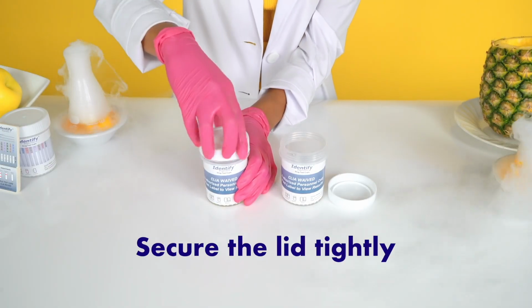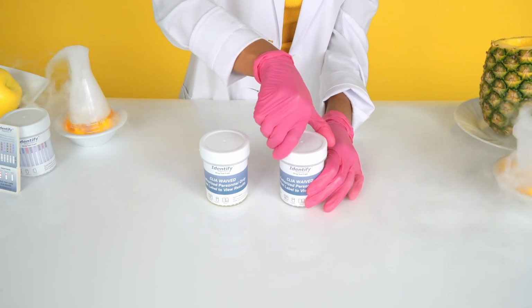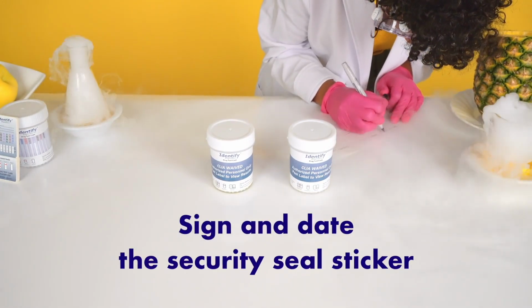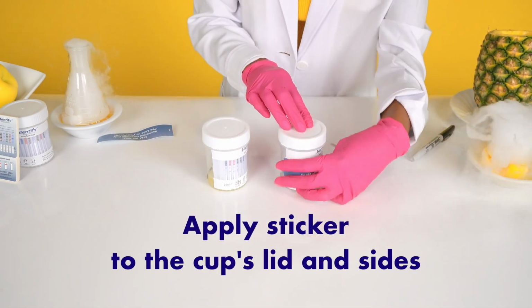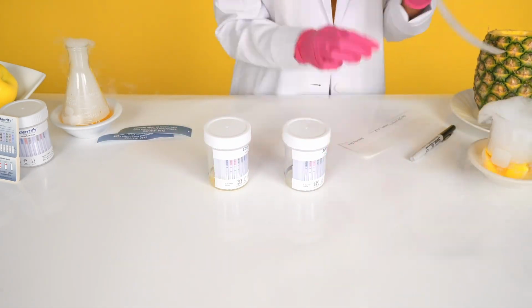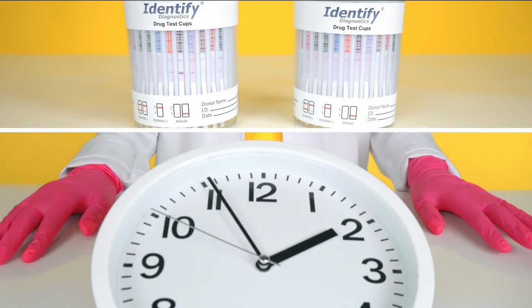Get the threading just right and screw your lids on nice and tight. Sign and date the included security seal sticker. Peel off the blue cup label to show test results. And apply the sticker to the cup's lid and sides. Look at Skylar go! Now start the timer for 5 minutes and counting.